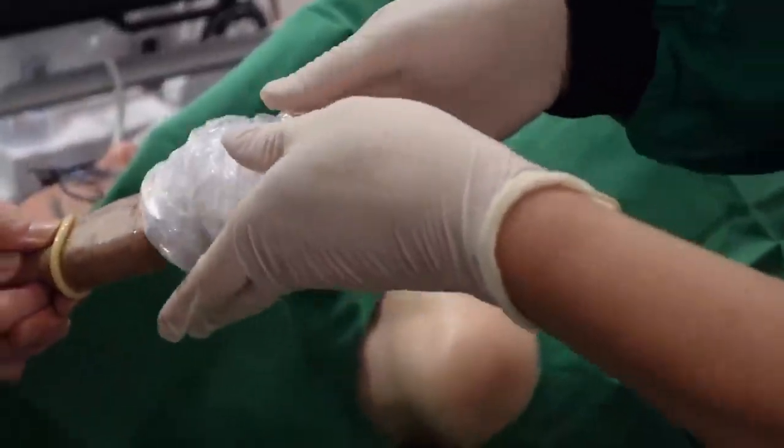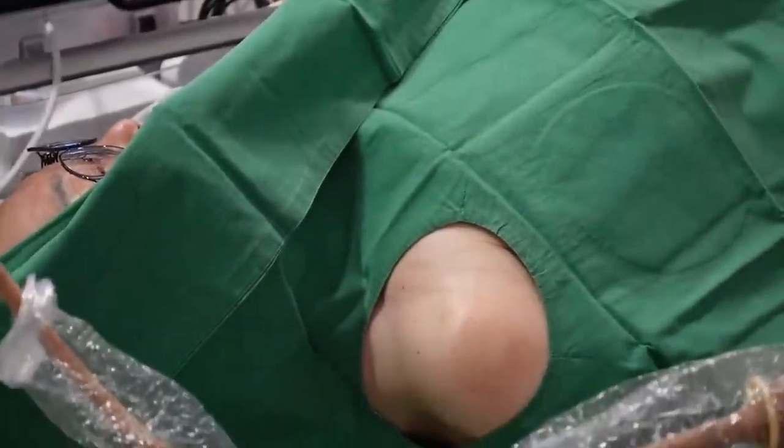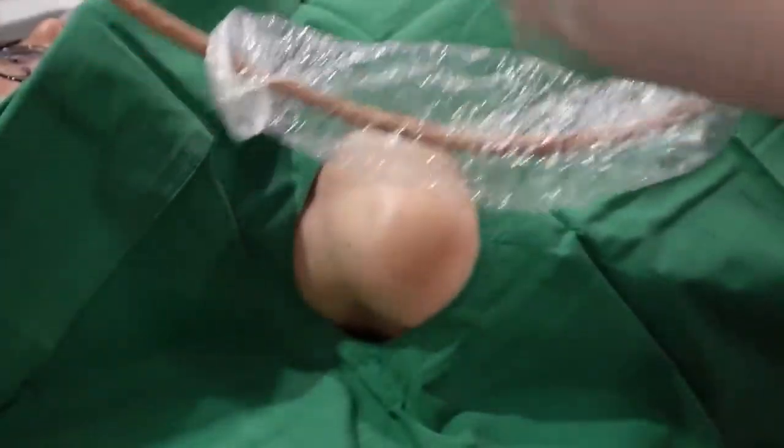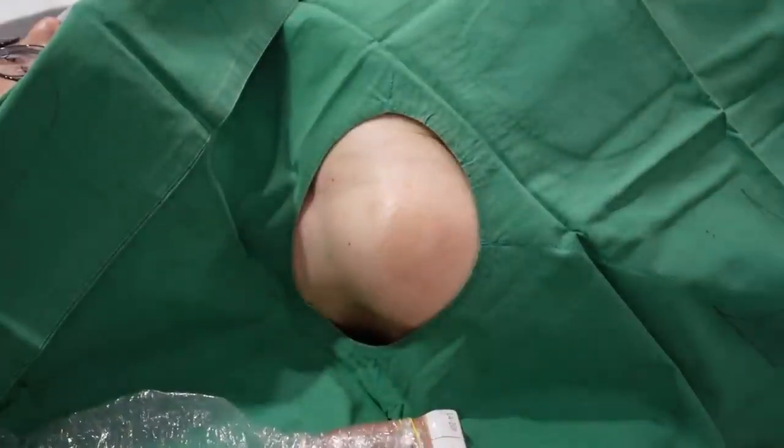I will continue to discuss the interventional pain procedure for glenohumeral joint osteoarthritis. Today, I will discuss the ultrasound procedure. You already understand the anatomy of the articular branch of the glenohumeral joint and the technique of the C-arm guided articular branch block of the glenohumeral joint.